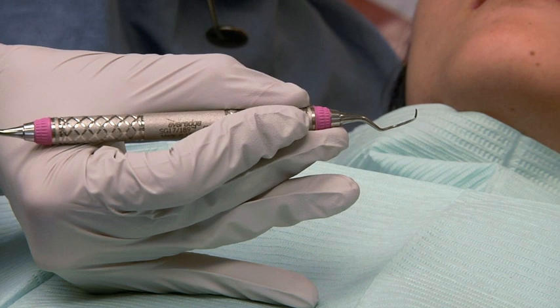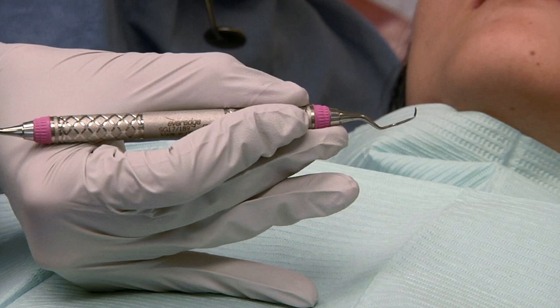Hold the curette using a modified pen grasp by using the dominant hand and holding the instrument handle with the index finger and thumb placed opposite each other. The middle finger should rest lightly on the shank, and the ring finger should be placed on an oral structure, usually a tooth, for support with the pinky finger relaxed nearby.